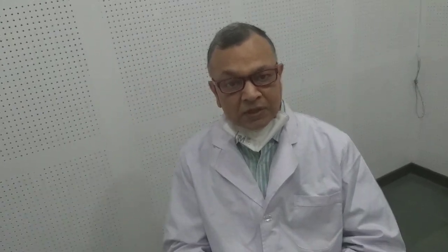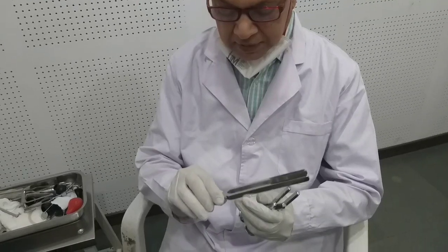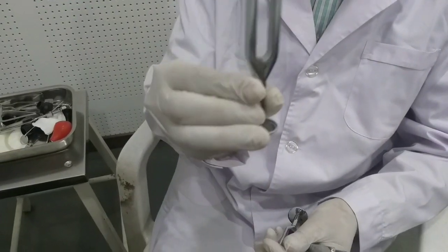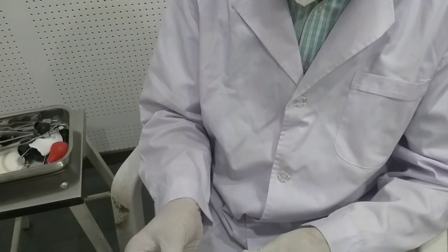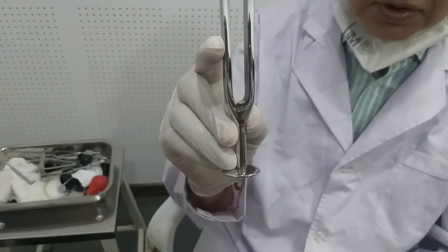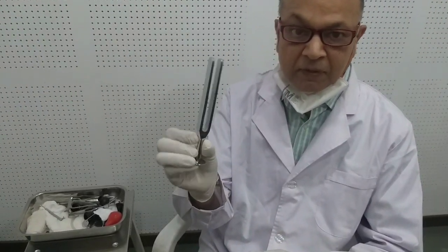So one by one, first I will show you the Rinne's test, then Weber, and in the last you will see the absolute bone conduction. We take three tuning forks — 256 Hz, 512 Hz, and 1024 Hz. We employ these three tuning forks for the hearing test, but 512 Hz is said to be the best, so I will perform all these tests with the 512 Hz tuning fork.